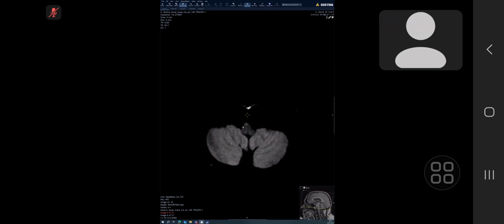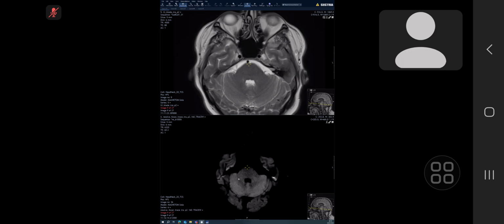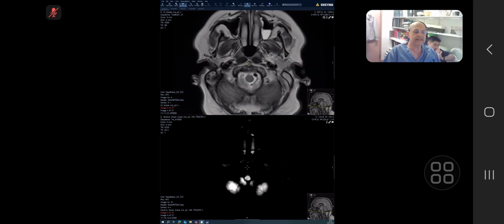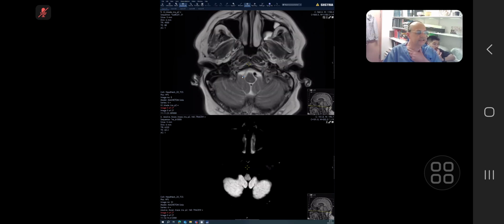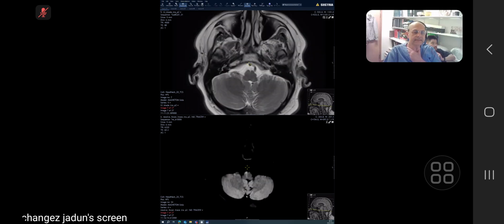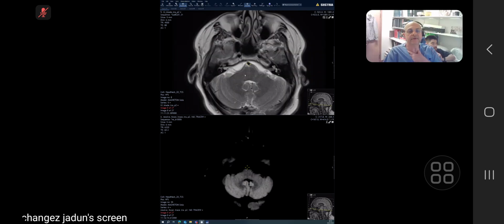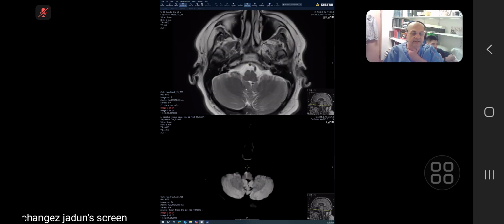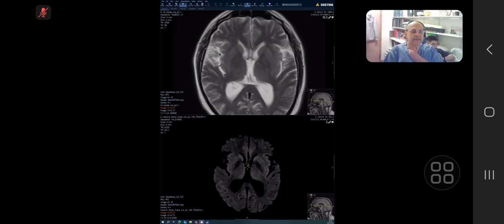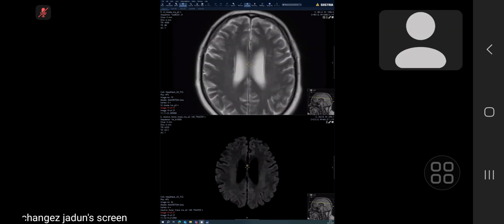So you see absence of signal even on the normal study of the brain with such a strong history that we gave you. There's a vertebral artery signal loss. There is diffusion restriction, and that goes in with the vertebral artery perforator infarct involving the medulla. It's a classical picture.